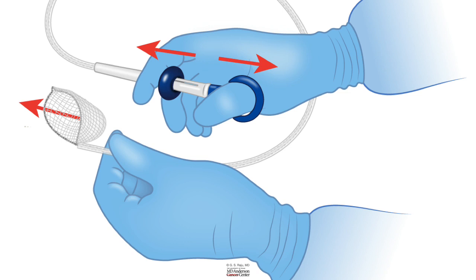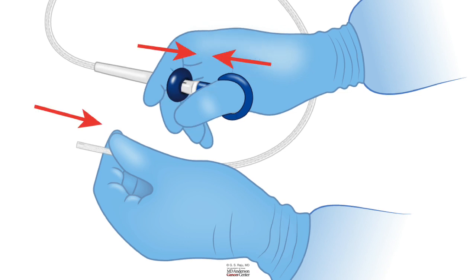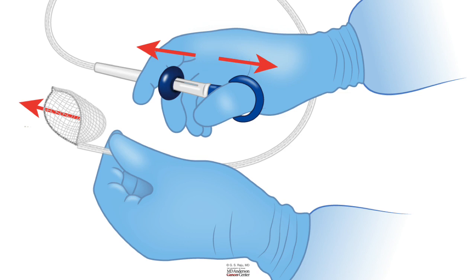And then when you close it, it gets enclosed in a plastic sheet. So you use this retrieval net with the net enclosed in the plastic sheet, and then insert it through the biopsy channel, reach out to the area of interest, and open the net, and then try to trap that polyp in the net and retrieve it.